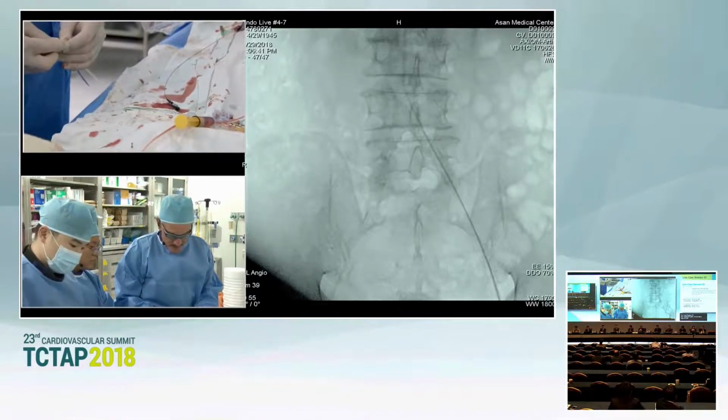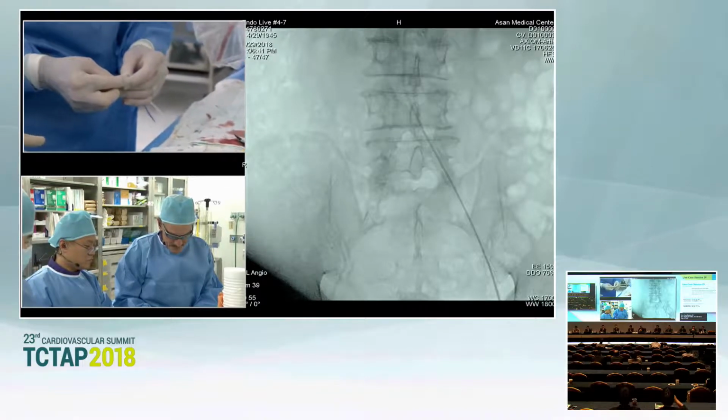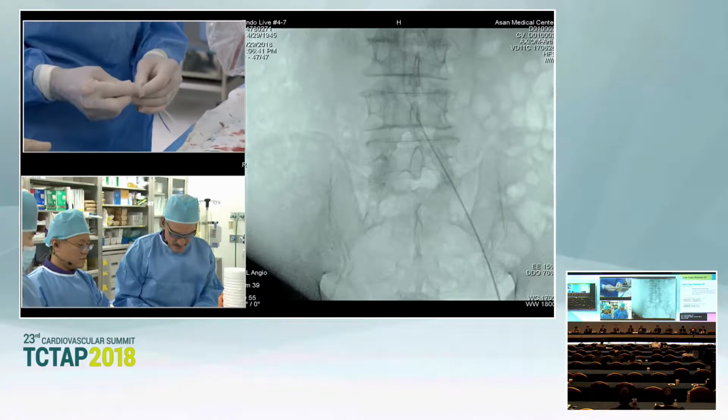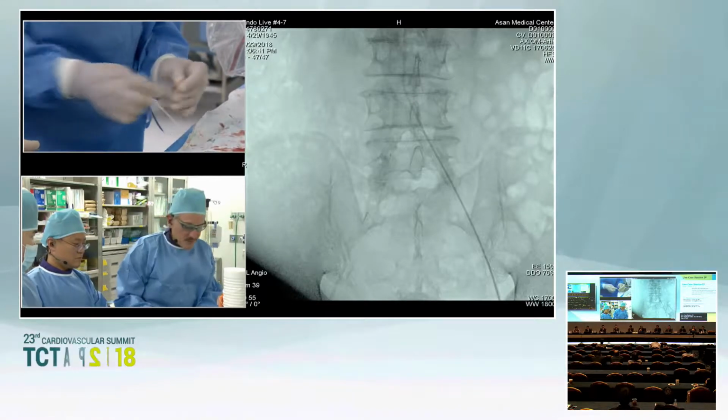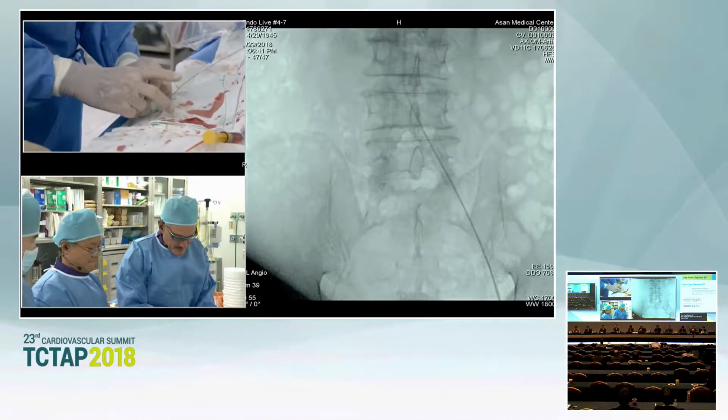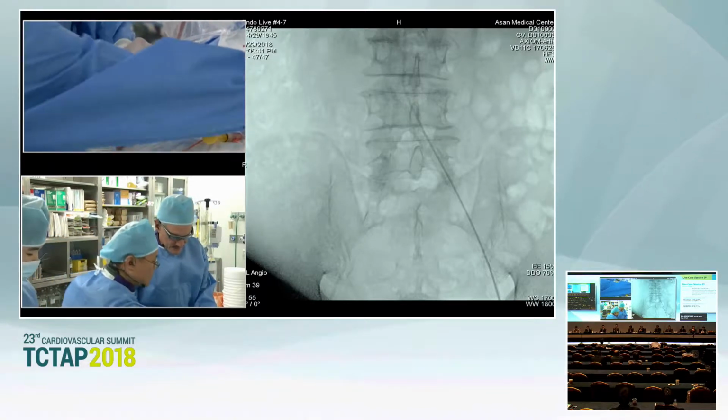Ordinarily, I would approach this at least probably half an hour before going live, but we really only got a chance to start a couple of minutes before. We just got the patient before he arrived, so you get to watch the entire approach live.